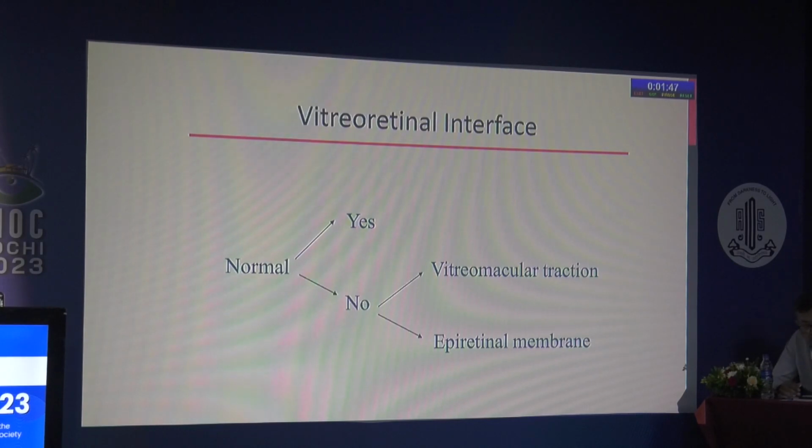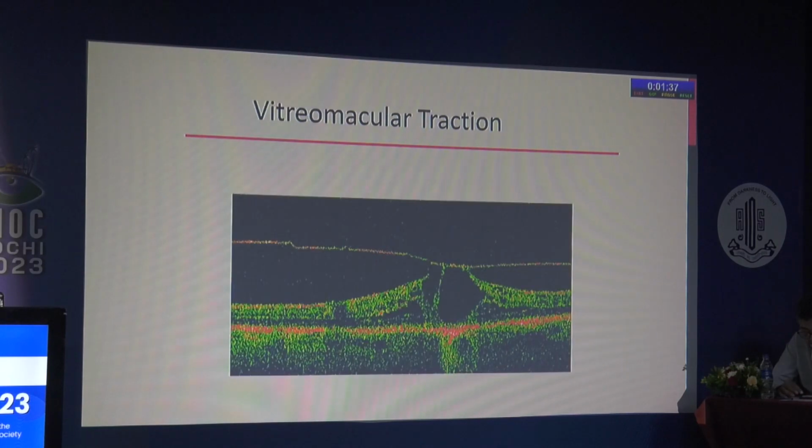Sometimes you might feel that you are not able to see that clearly in edema in diabetics, but vision is poor. When you do an OCT, you find very clear-cut VMT, and this of course is a clear-cut indication for surgical intervention. You must have seen all these pictures over and over again, but it's very important from the patient's and the surgeon's point of view. Clinically you see, okay, it looks all right, doesn't look that bad a macula, then you do OCT and you find this picture, and it gives you the whole idea of the poor vision.